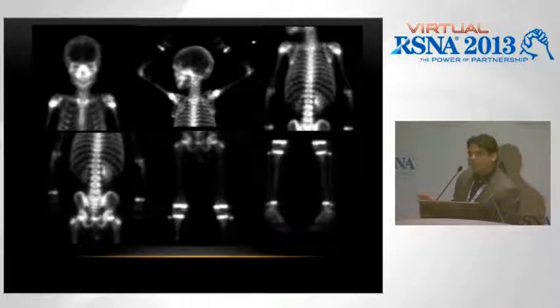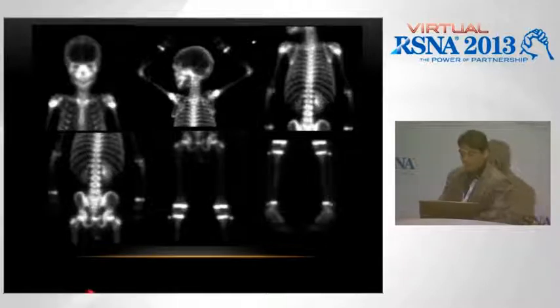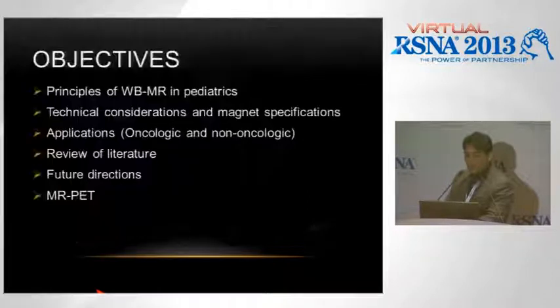I'm going to share some of my experience at Texas Children's with you and show you some case examples as to where we've been using it and where we've found maximum benefit, and the protocol sort of revolves around those areas. So this is the traditional method, obviously, of doing whole body imaging. We still do technetium bone scan for a lot of our indications, and changing that paradigm clearly for a lot of things is going to be challenging and will require a lot of work.